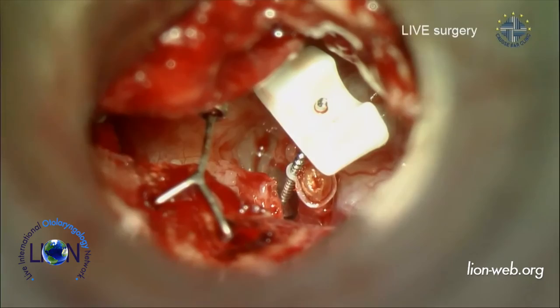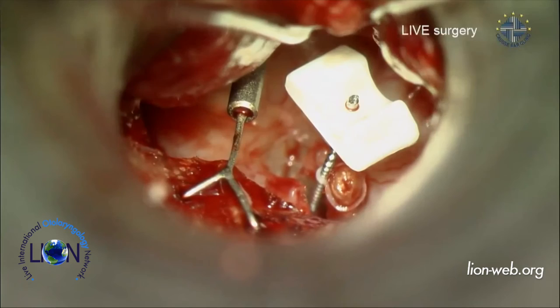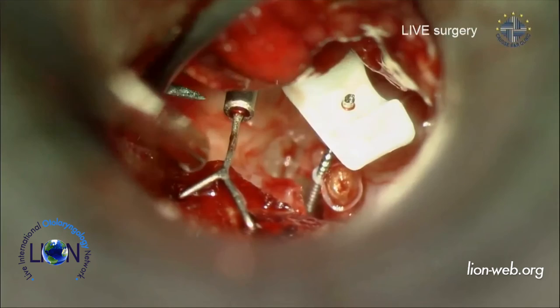So what are you going to do about the protruding titanium? Oh, nothing. It's fine, because it's not a very big one, so I don't think it's going to change. We'll see that, because it's titanium, so it can be in contact with the malleus handle. It's not a problem. Okay, let's see what happens now if I replace the malleus handle within the groove.